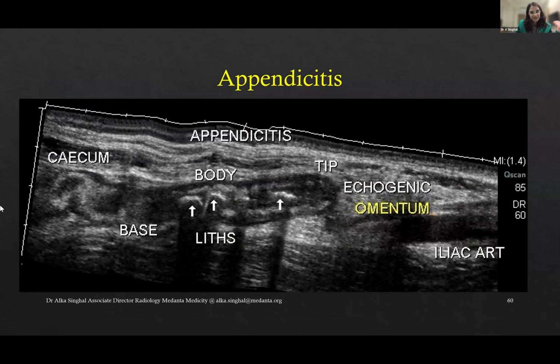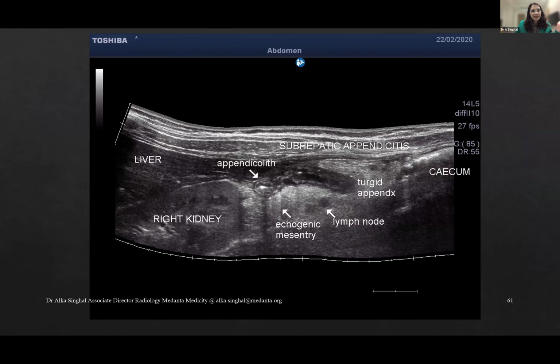And this is just a panoramic view showing the appendix with calculi and shadowing. And I'm really grateful to my colleagues for the wonderful images that they've shared with me to share with all of you. Thank you so much. And again, a panoramic view, which is showing the calculi and the shadowing of the organs.